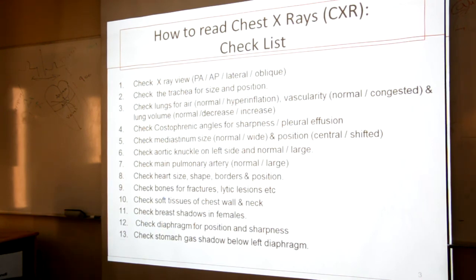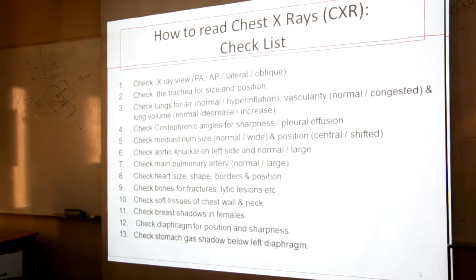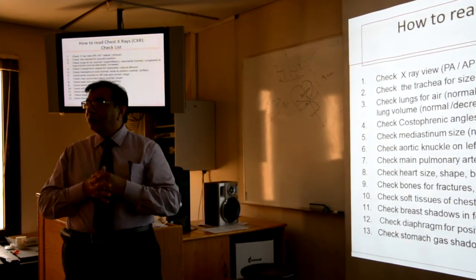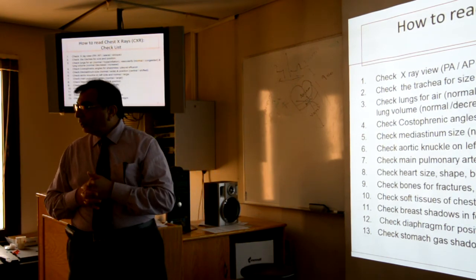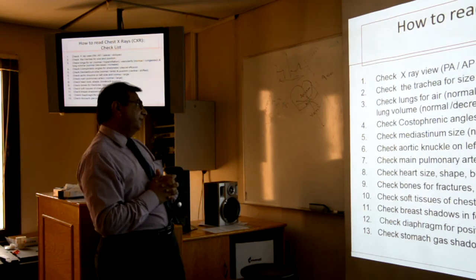Whenever a chest X-ray film is in front of you, as we discuss in the cardiovascular system, first follow some technical aspects. Check the name, ID, date. Check whether it's a PA X-ray or an AP X-ray, which view is this? Was the X-ray taken in the correct position, checking whether it is central or not? Is the exposure good or not? Is it an inspiratory film or expiratory film? We discuss all these things in detail with the cardiovascular system.